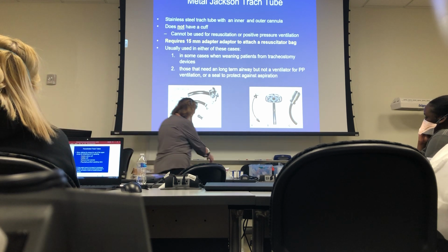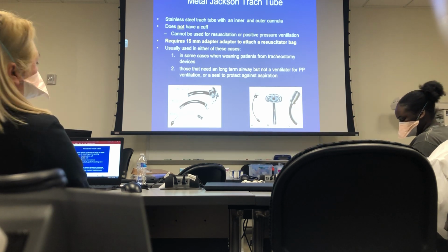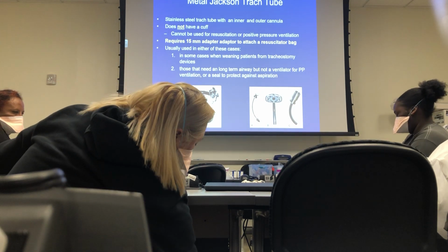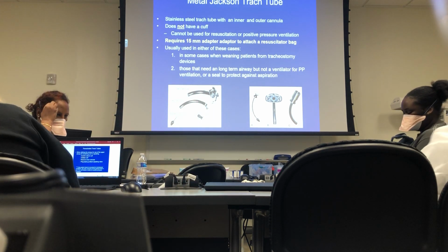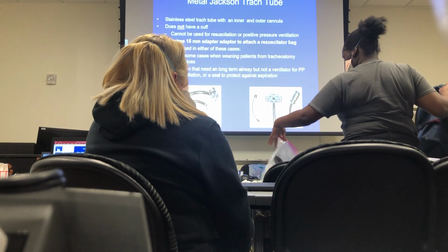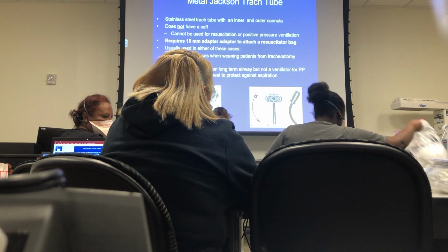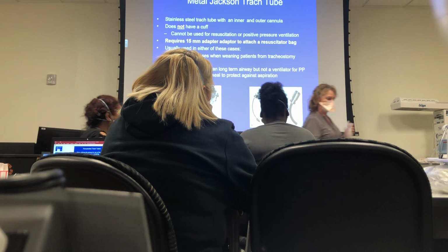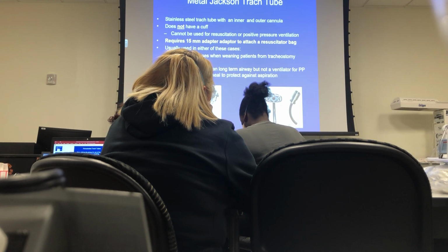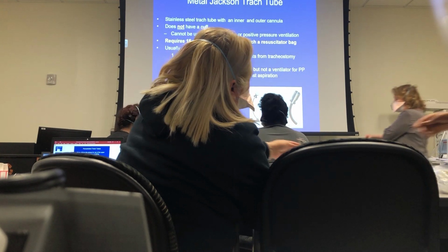I have 3 Jackson trachs, so I want you to sit together. These are permanent trachs, okay, for people that need to have a trach but don't need a cuff. What's missing on those? The cuffs or the obturator? They do have obturators, for insertion. But there are no cuffs on those, right? And there are no pilot balloons.